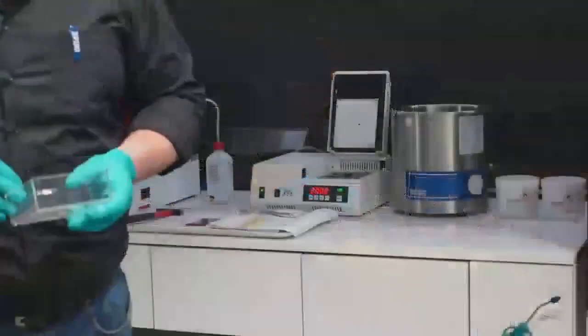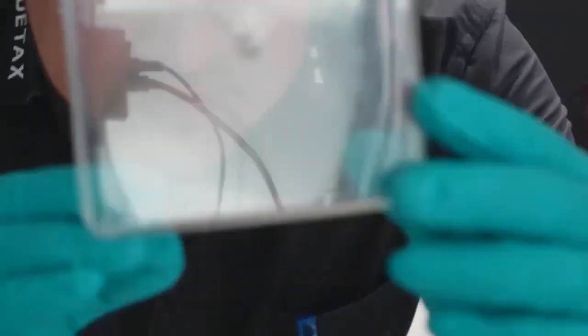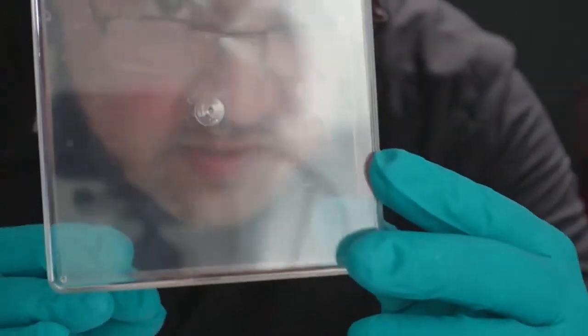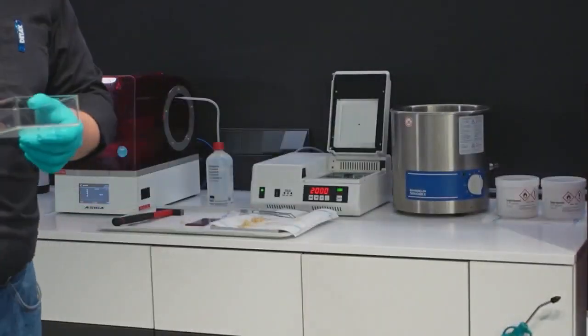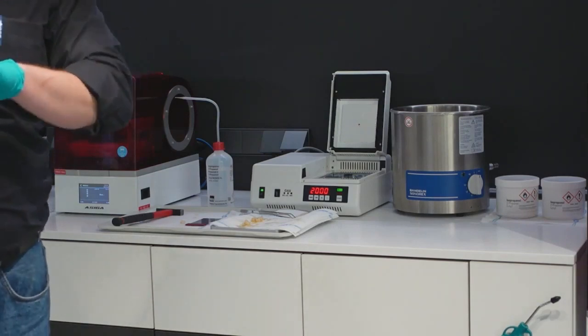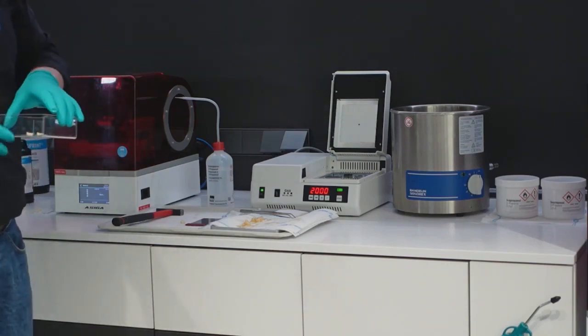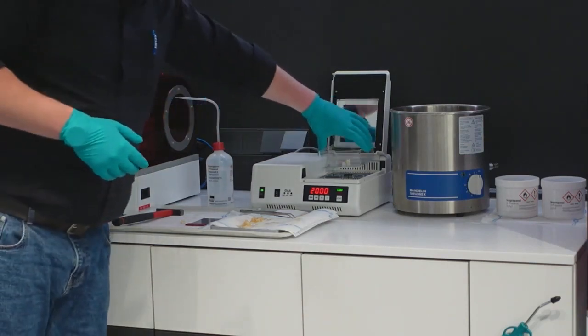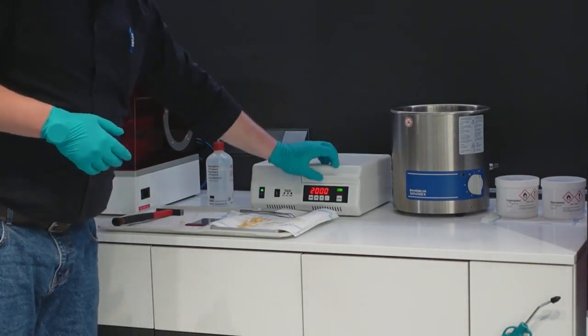I can't say it often enough. This one is clean, the same as last time. If you can see me, it is also possible for the light to reach the objects. If you can't see me, if it's too dirty, please don't use it, because there's not enough energy to cure the material finally. Take it inside the auto flash.